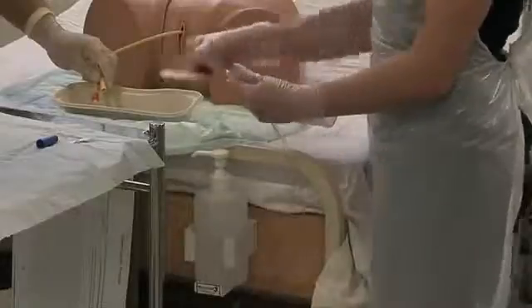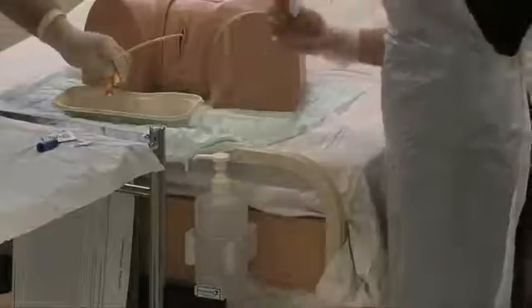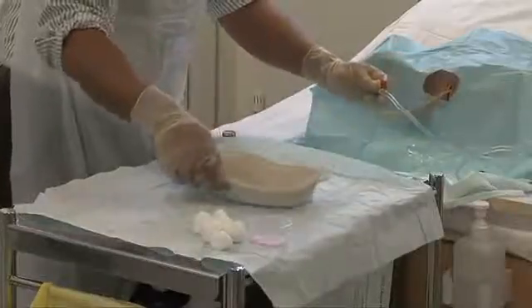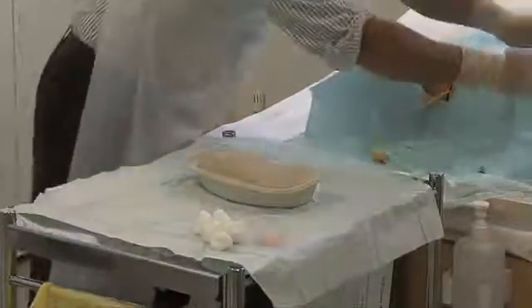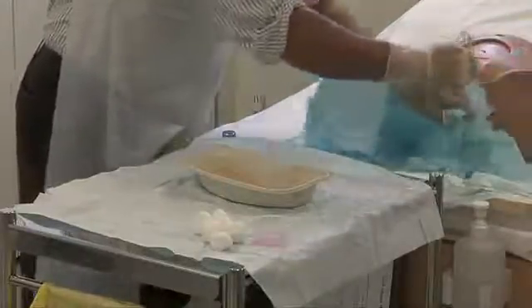Cleanse the drainage tube with an alcohol wipe and attach it to the catheter, ensuring that the bag is secured and that the tube is positioned in such a way as not to occlude the lumen. Remove the drape and dispose of it as clinical waste.